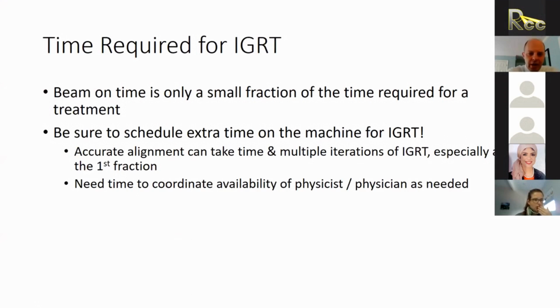So yeah, just another note about the time required for image guidance, to be sure that you schedule appropriate time.